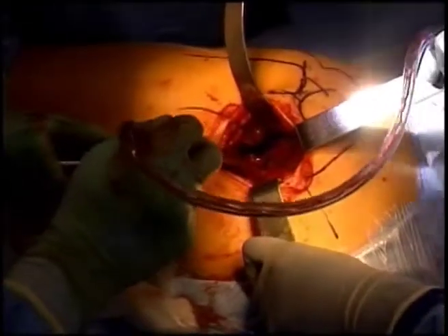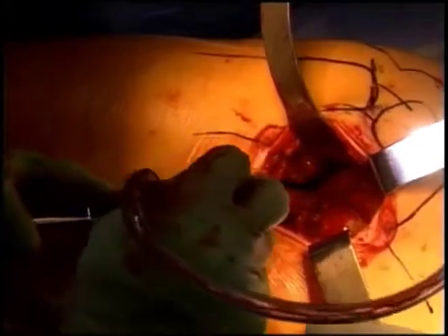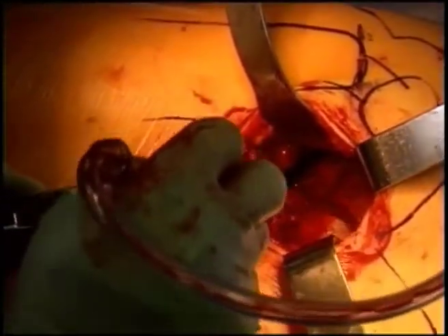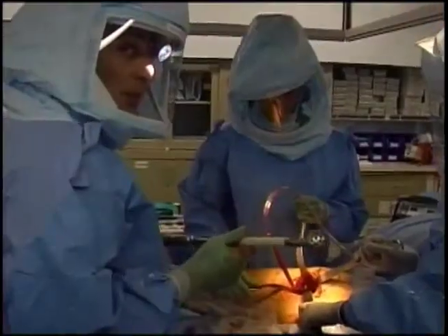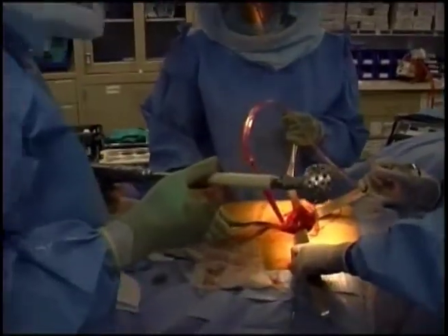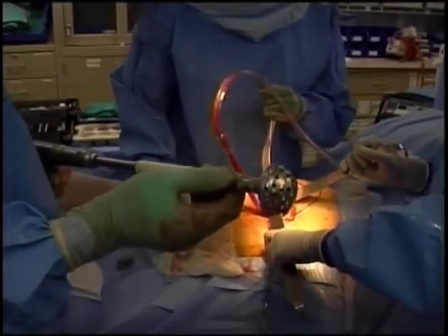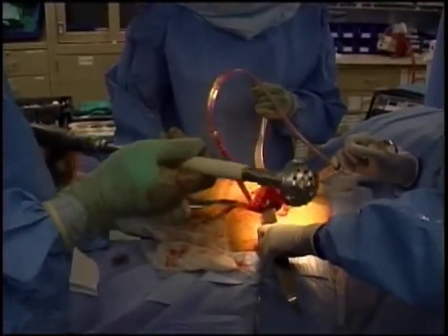We're now looking at the patient's acetabulum or the socket of the hip. It is a round socket, extending deeper in toward the pelvis. There's a bone spur — an osteophyte — which we're going to remove as part of preparing this socket for the hip replacement. In preparing the acetabulum, we use a reamer that, just like the broach on the thigh bone, sequentially enlarges the hip socket until we reach a size that will accept the final cup. This powered reamer ensures precise bone removal.